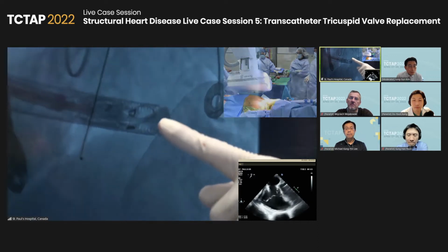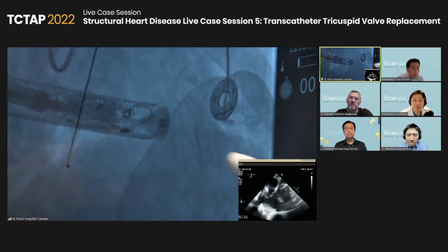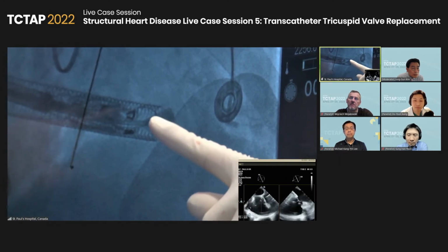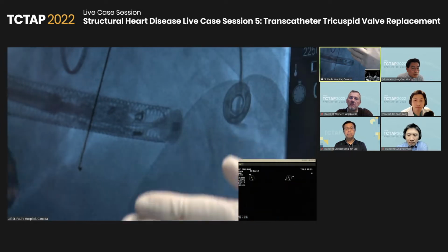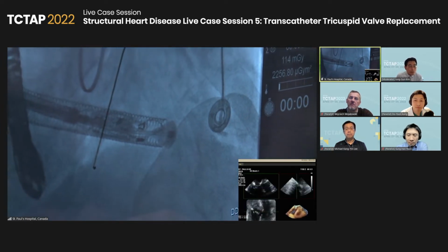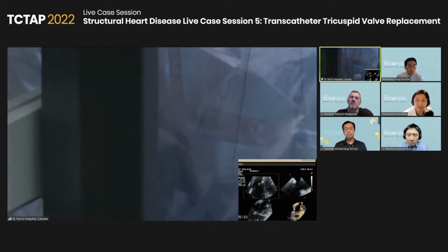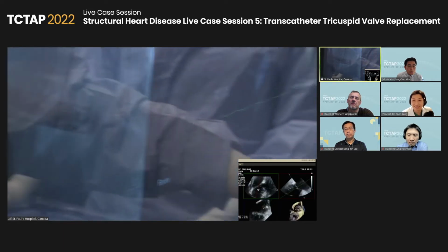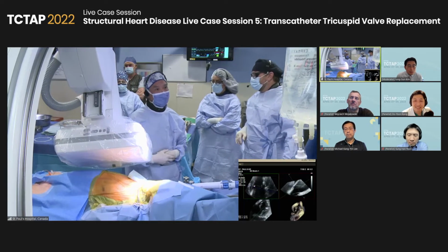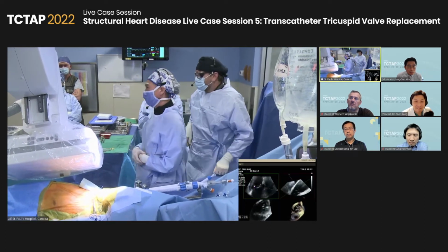You see these two particular dots right there and there. That is the subannular taps. I want that to be below the annulus, which we have the plane. We have a line drawn onto the screen to allow us to see the depth. Okay. So actually, I think the depth is pretty good, in my opinion. So I think we are reasonably central. I mean, we can't get it 100% centrally, but I think that's decent.